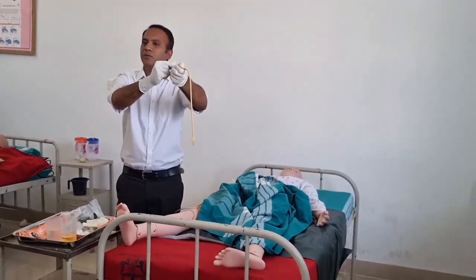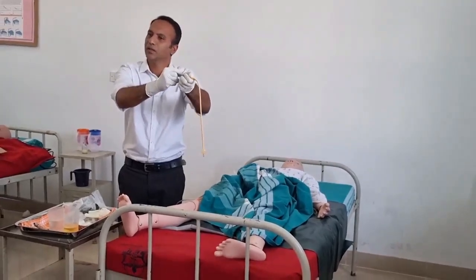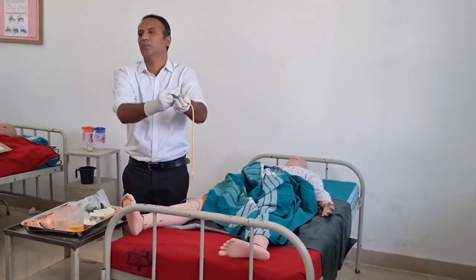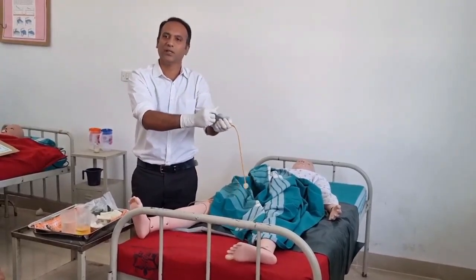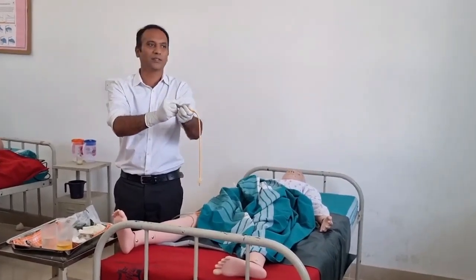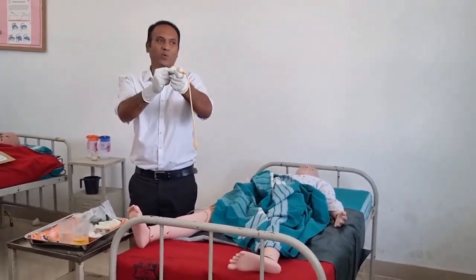Okay. So the other type of catheter is the temporary one. We do not call it an indwelling catheter. That will just serve the purpose of one-time use. Any patient who comes with urinary retention, at that time we use it, we drain it out and we discard it. So hope you all understood the indwelling catheter, this Foley catheter, and the technology, how it works.